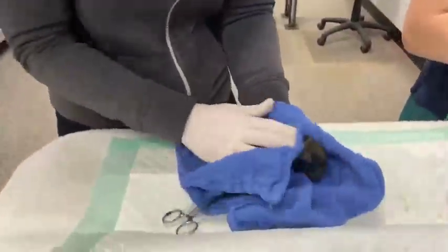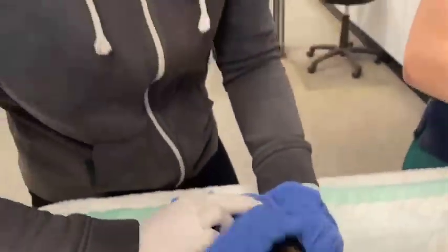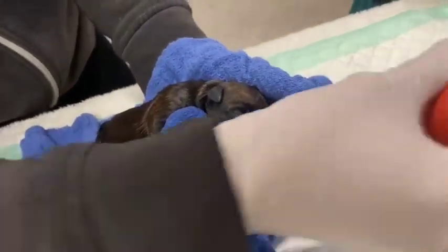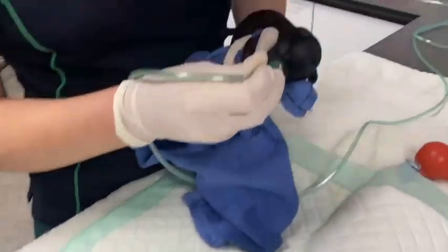We're just reviving the puppies, stimulating them to wake them up, and also removing any liquid from their mouths to make sure that's nice and clear.